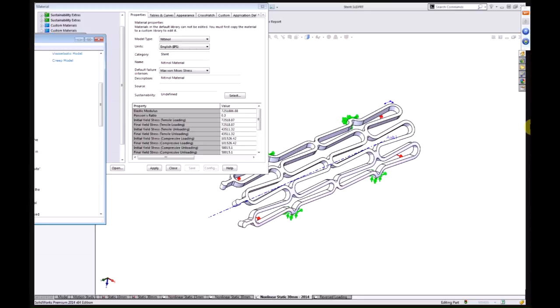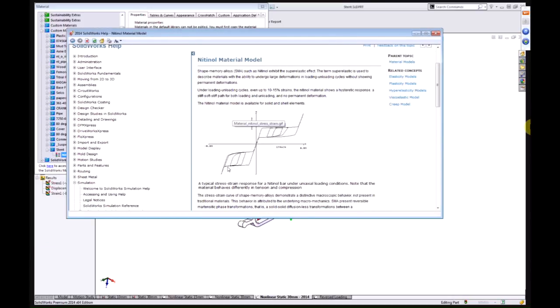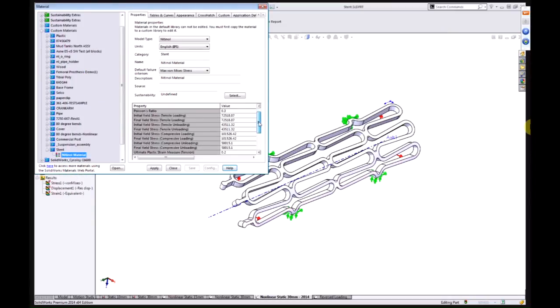So highly nonlinear behavior, and the way we define these curves is by identifying these breakpoints and the slopes of the lines as they move through this pattern. All the data that you see expressed here is information about the loading and unloading behavior of this nitinol material. I start off with some sort of reference pressure on the inside, and if I run an analysis on that to see how it expands, we can actually get quite a long way.